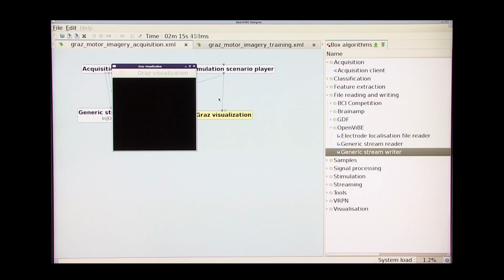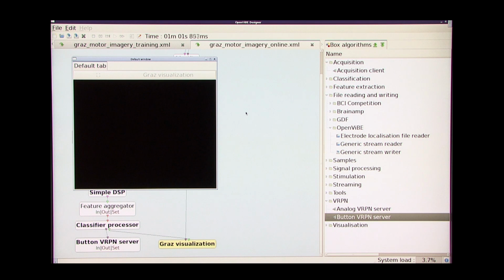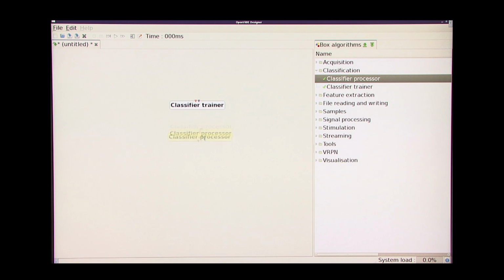At the same time, the software learns the user's different reactions to the commands that he is given. Imagine a right or left-hand movement, for example. The software will then classify this mental state and categorize the characteristics related to the user's thought.